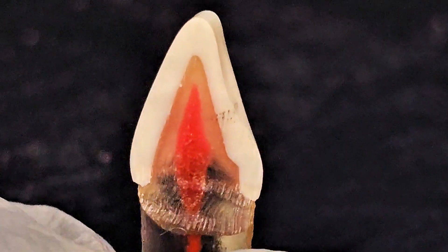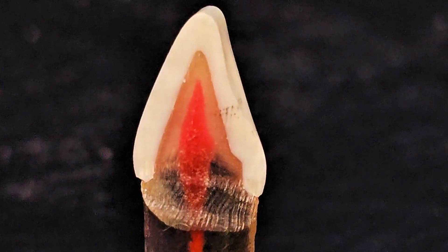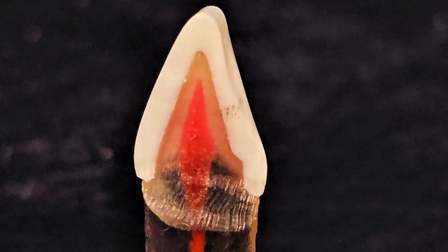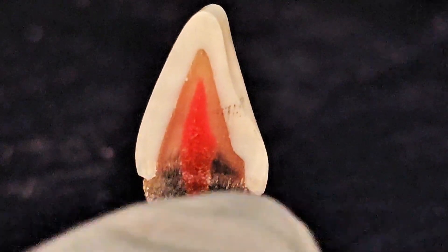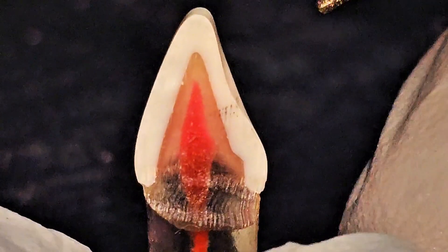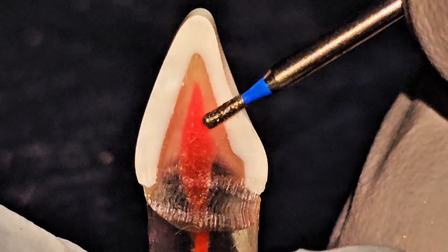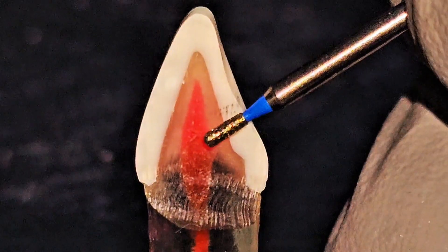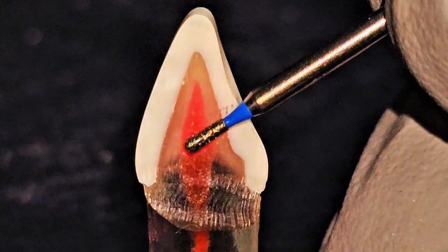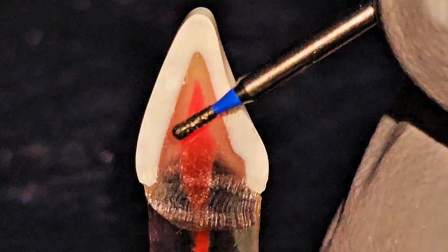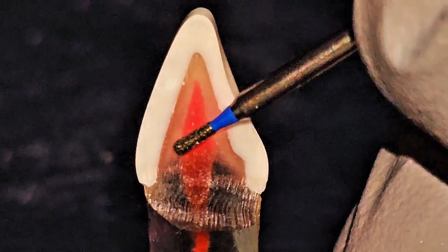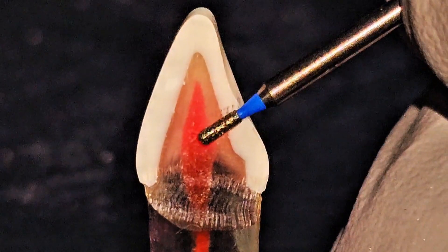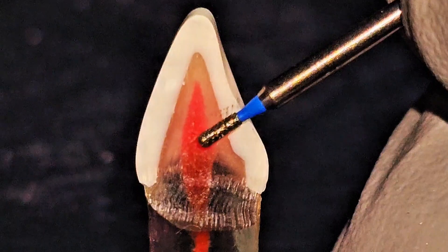So you penetrate with any bur. Probably I would prefer to penetrate with the 330 bur. Let's see whether it can reach all the way into the pulp. So let's say if I'm approaching with 330 bur - boom! With the full depth and not hitting the blue band it penetrates. But if I go beyond the blue band probably I'm damaging a little bit of the labial wall. So about this much, slightly into the blue band then I am into the pulp.